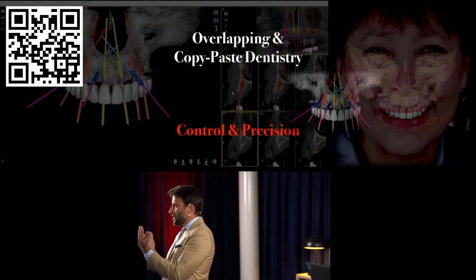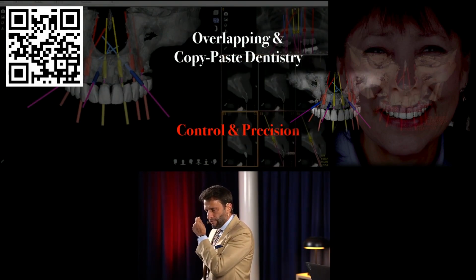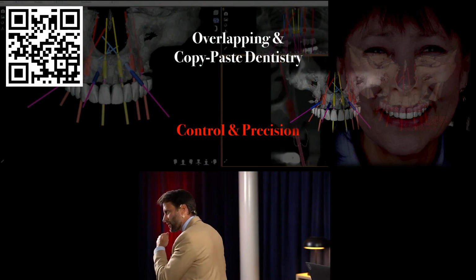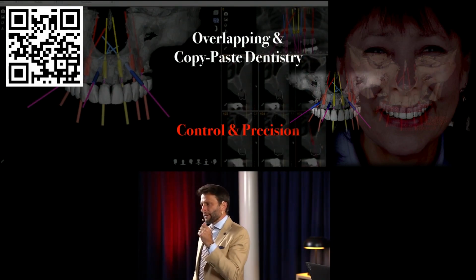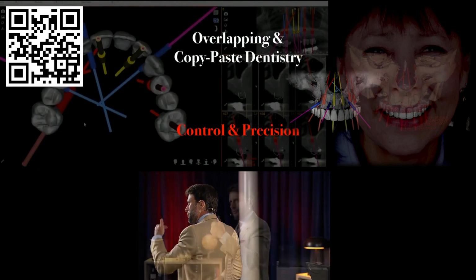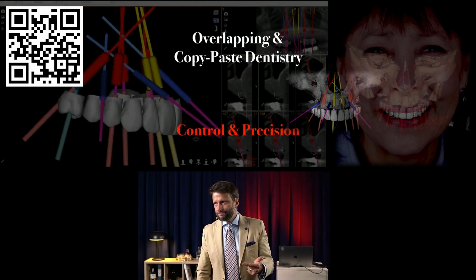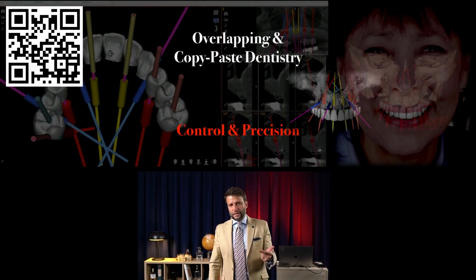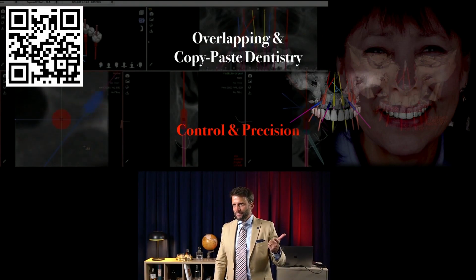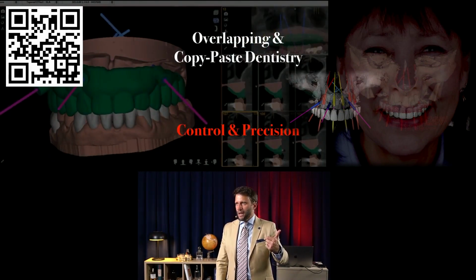overlap. So if I scan a full upper arch, all the teeth, and then I prep all the teeth, and I scan all the preps, how can the lab overlap the file of the teeth before prepping and all the teeth prepped? If you prep all the teeth, you need to rely on the gum. You need to rely on the palate, the tuberosity. That's where the software is going to find the information.